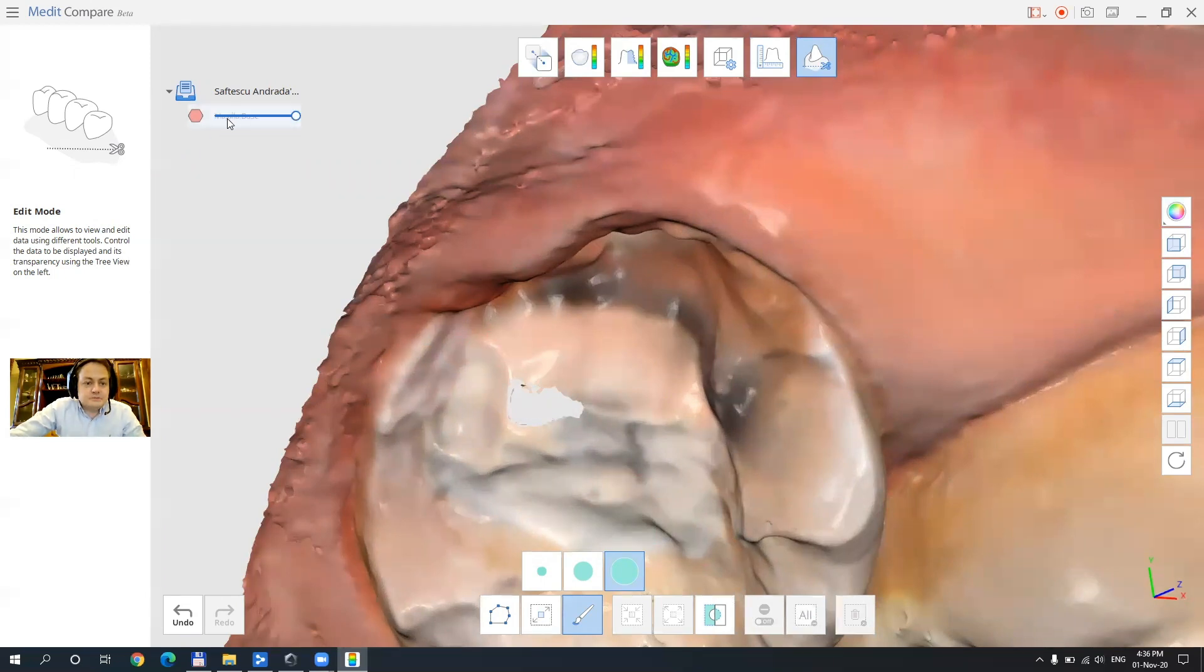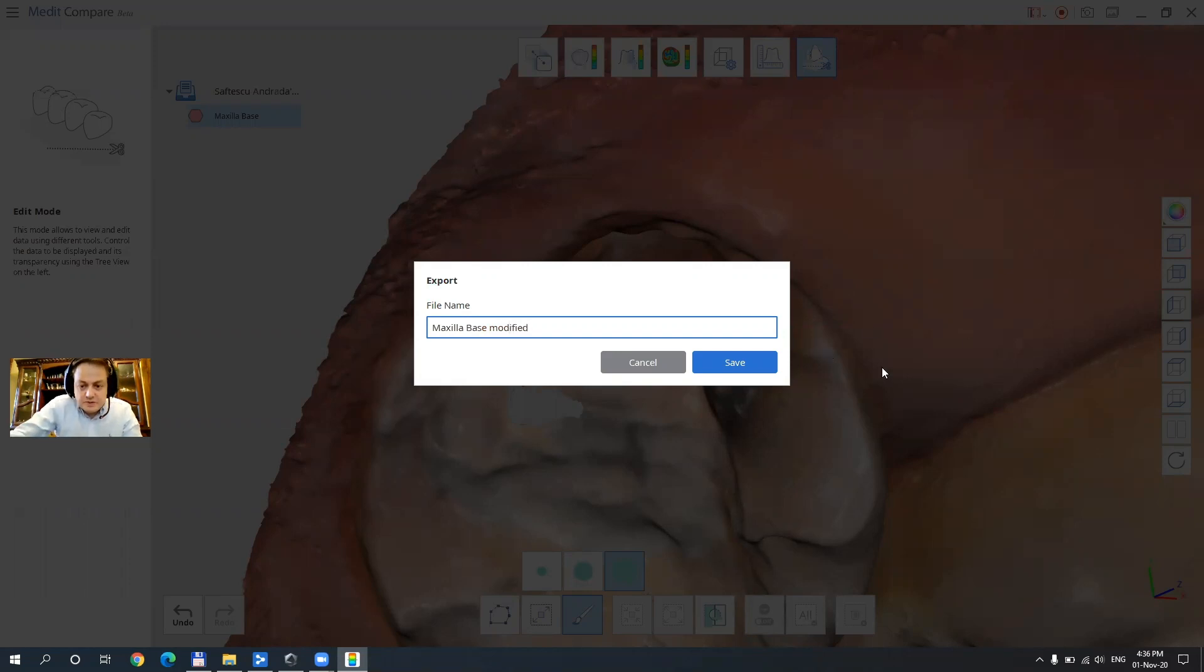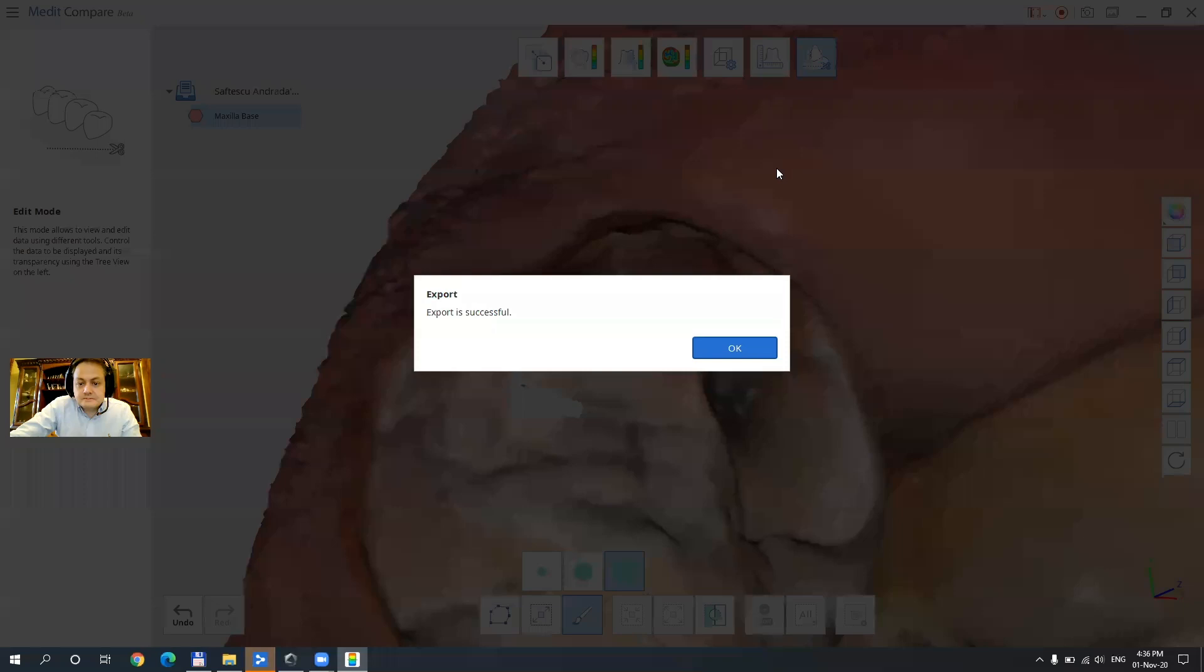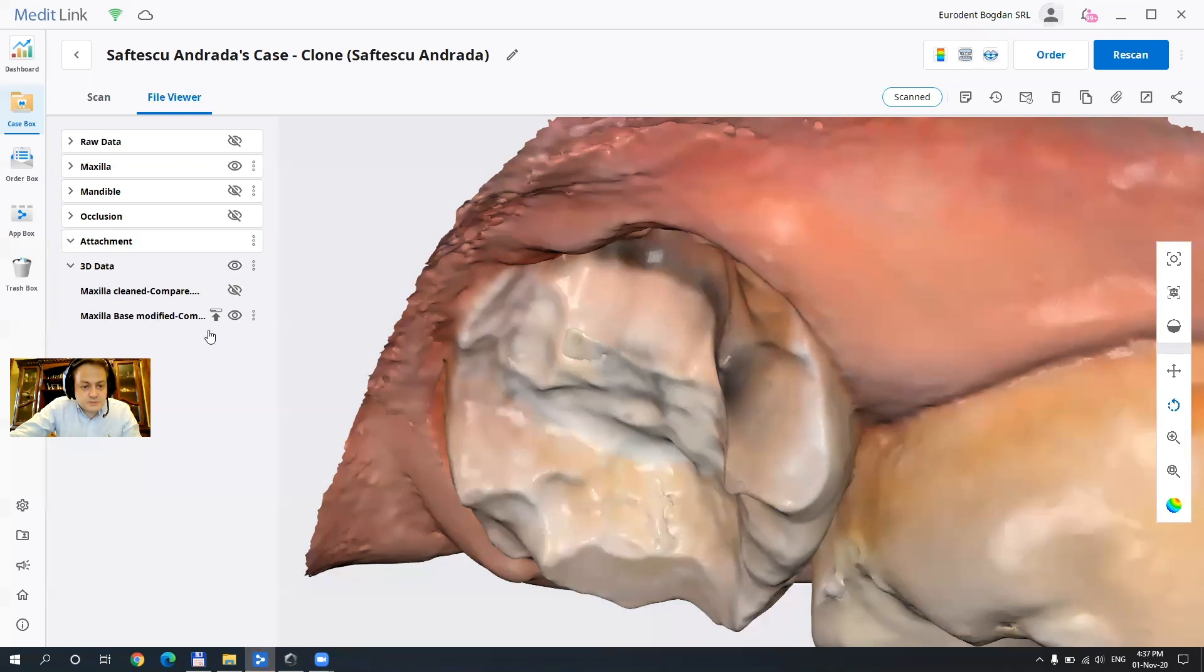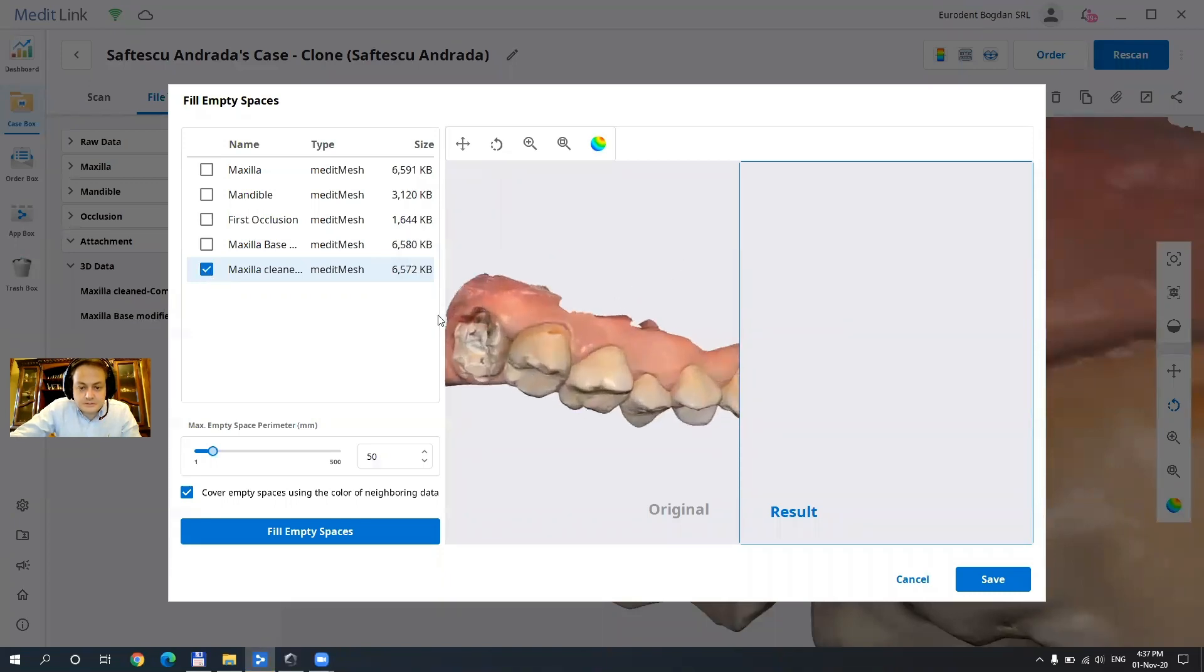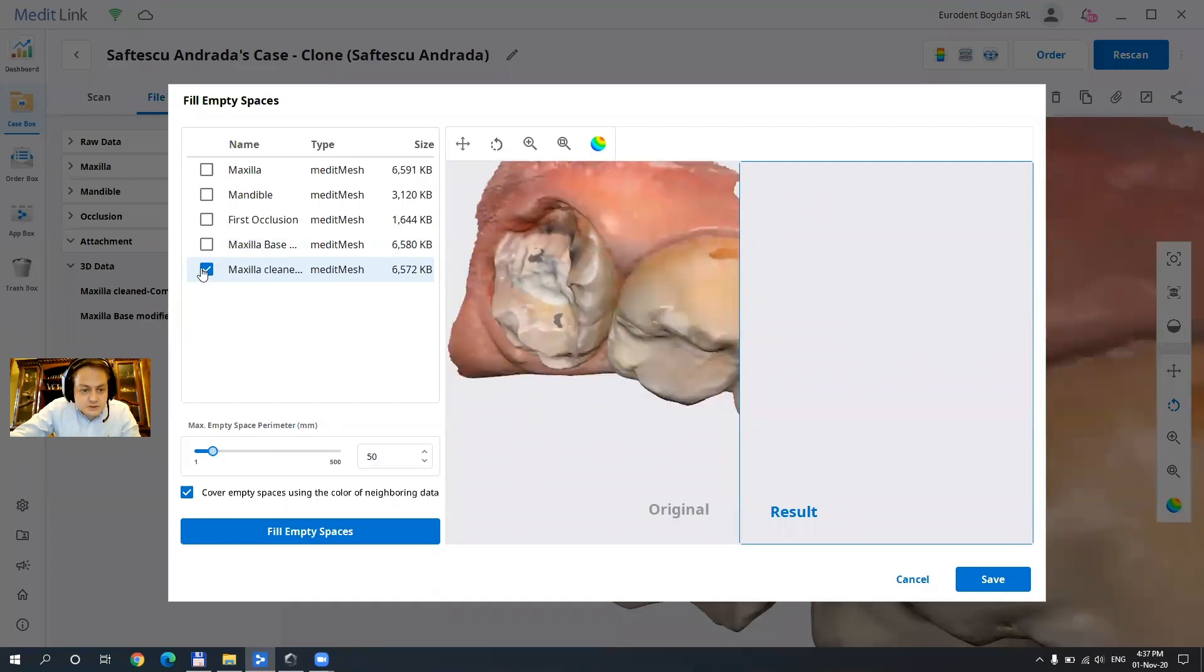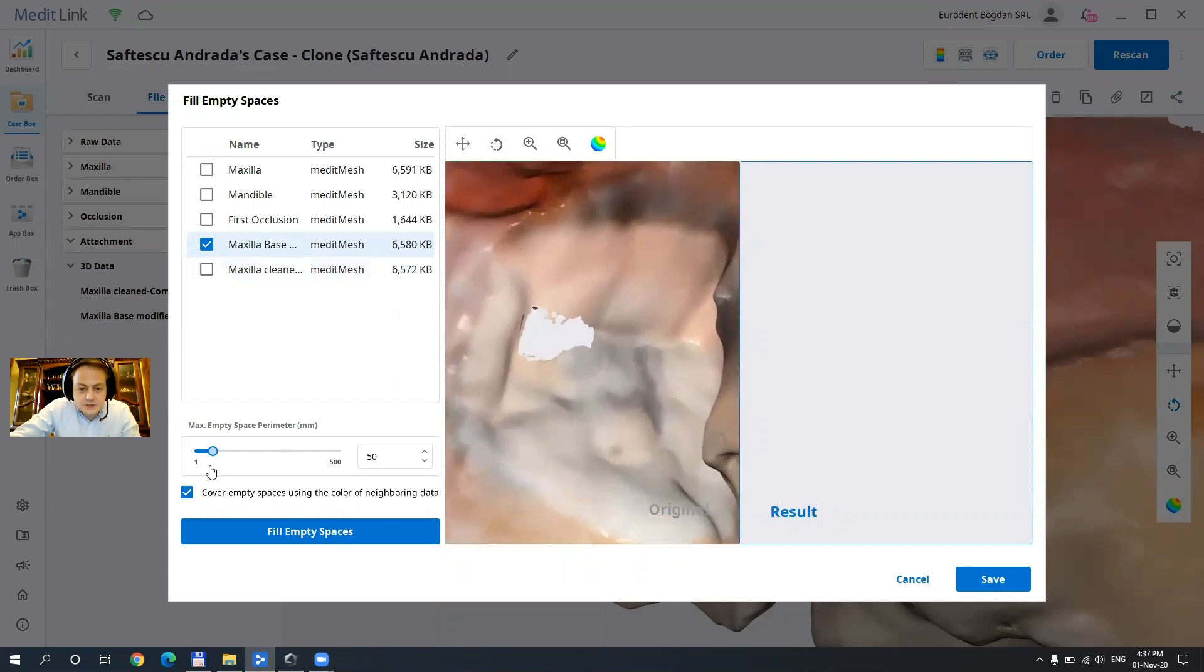And now if I exit the case but before I export the new maxilla base as a maxilla base modified I am going to be able to see it in the scan. Okay export is successful and right here if we see the treated data we'll be just able to close the hole that we just created with the closing tool. This is already close, just one second, yeah here we go.